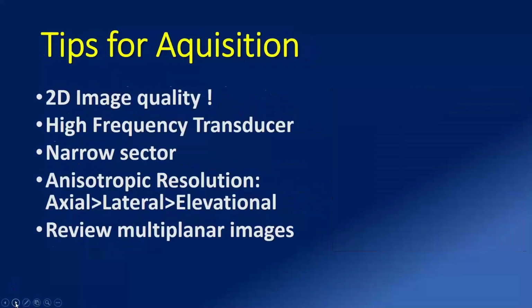But again, when we move to 3D echocardiography, we have to keep in mind some tips for the acquisition. First of all, we need to have very good 2D image quality. If the 2D image quality is not good, 3D echocardiography is not going to help us.